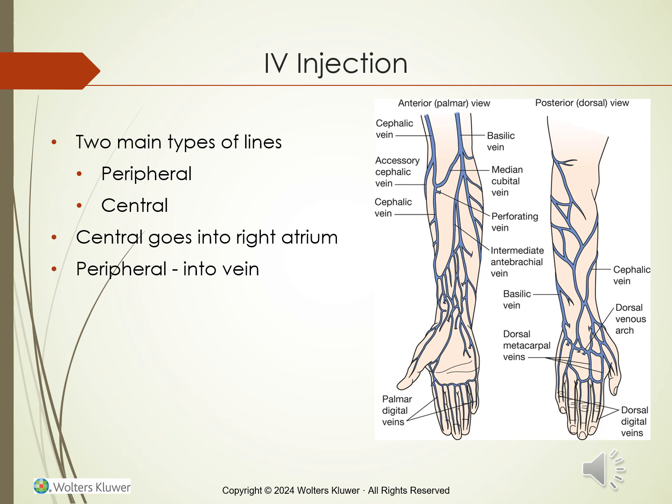Pediatric patients often need extra care as they might be frightened and have trouble staying still. If possible, a parent should hold the child's arm to help keep them calm. Pediatric nurses or specialists should be consulted for vein access in young children using the appropriate size needles.